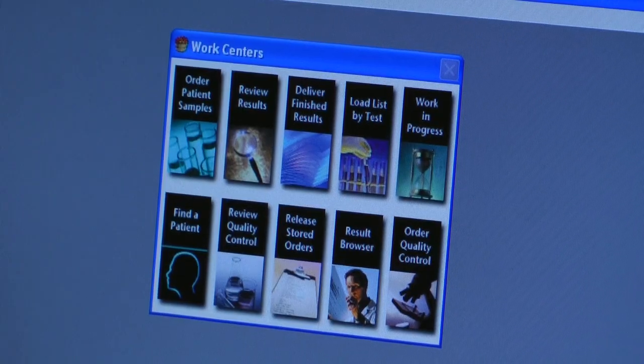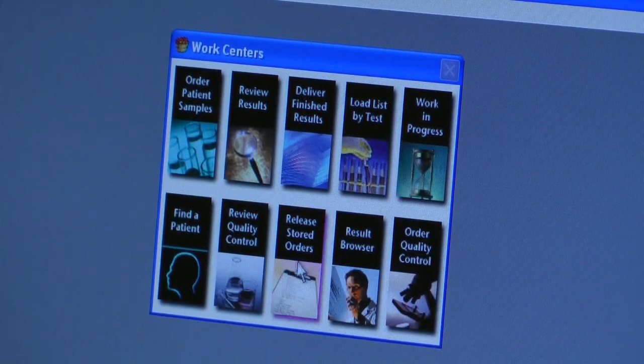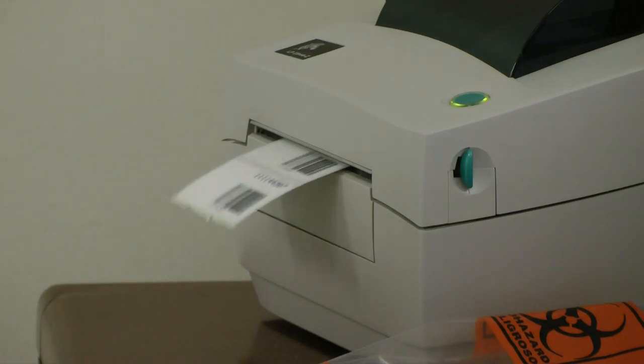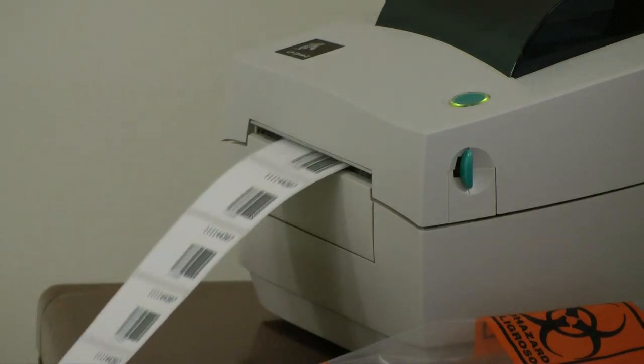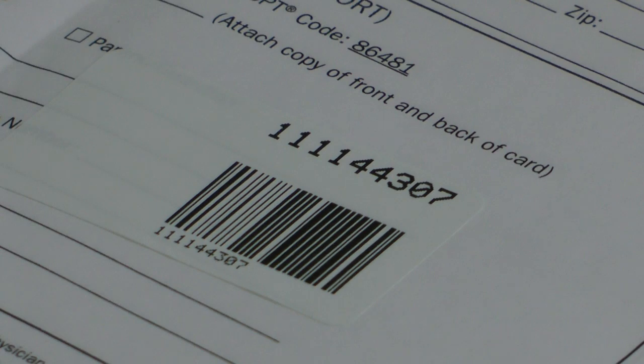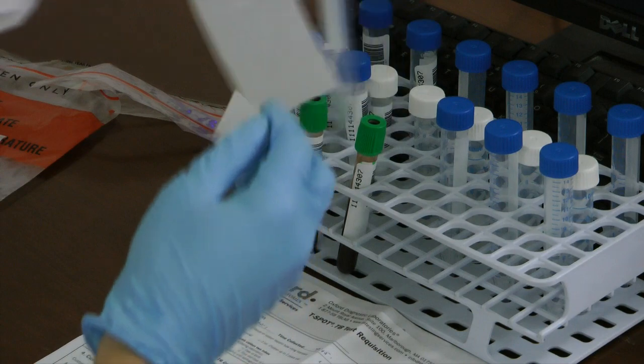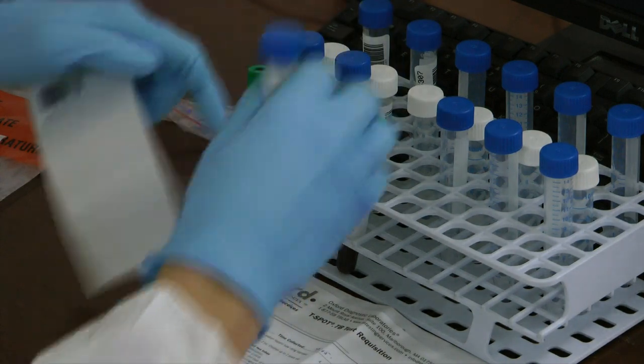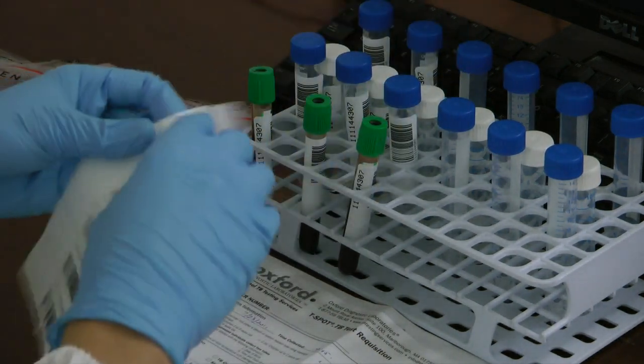A T-Spot TB test is ordered in the laboratory information system and an accession number barcode is generated. Barcodes make recognition of each test sample simple in the automation instruments. The technician labels centrifuge tubes and a Leukacept tube which are used for the pre-analytical steps.